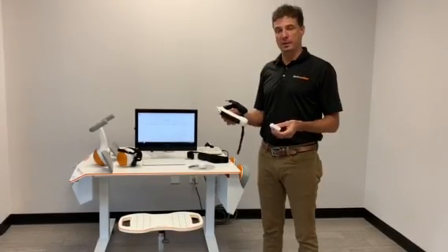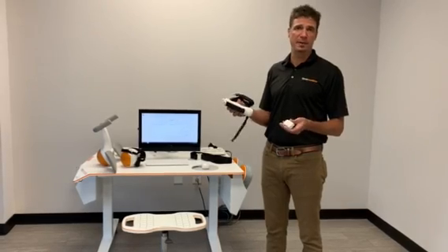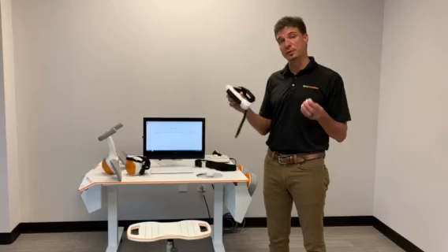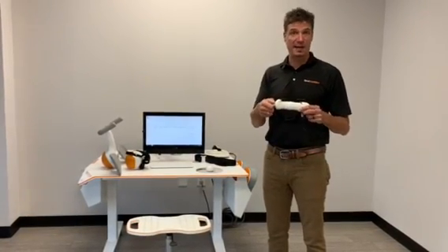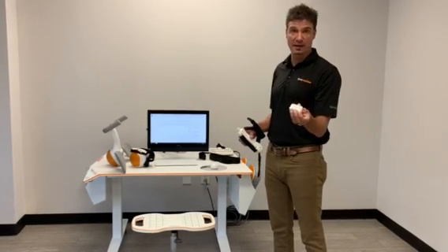Hey everyone, today we're going to be talking about the Pablo, which is our sensor-based technology. The device is comprised of three separate sensors. We have a hand sensor and a pinch sensor which detects grip force or pinch force. We also have motion sensors, which look like these little rectangular sensors here, which detect motion.